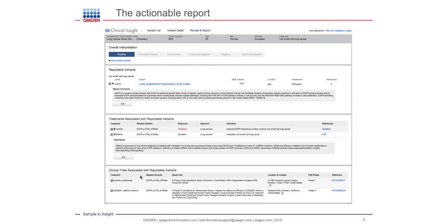And that today, throughout the 5 use cases that we will take a look at, the end goal is to put yourself in the place of a clinical laboratory, and see how a platform like QCI can be used to essentially answer the 3 basic but important questions: is the variant that is in that data set real? Is it meaningful? Is it actionable? So in today's presentation, throughout these 5 case studies in breast cancer, we will use that to illustrate the breadth of knowledge of QCI and how QCI can be used to help answer these different questions.